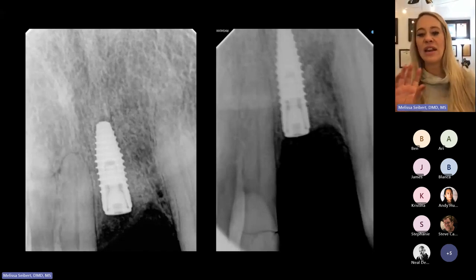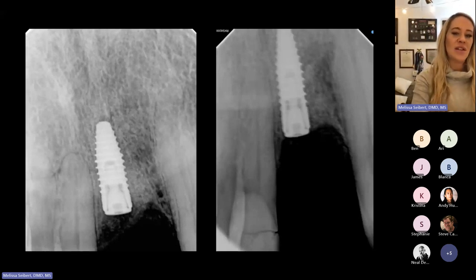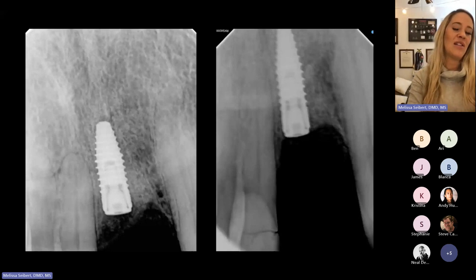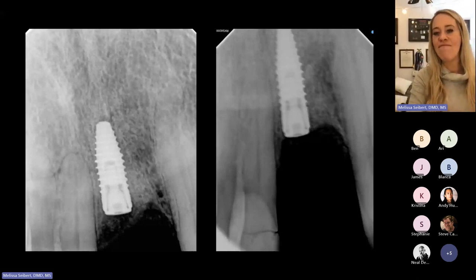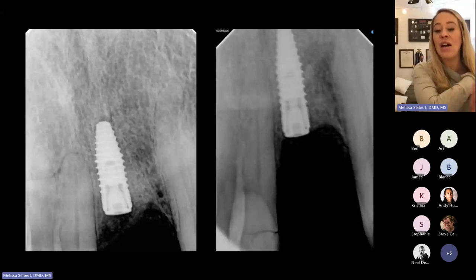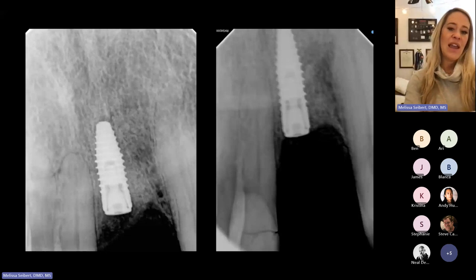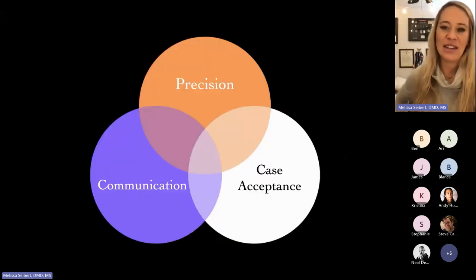Here are different radiographs showing the shaping drills and two-millimeter twist drills and what they look like. There's the final implant placement. This radiograph is distorted — keep in mind you're going to look at it and say the implant looks really far apically, but it is distorted. I generally plan my implants about two to three millimeters from the proposed CEJ. We also crown-lengthened this patient at the time of implant placement, because he had really big teeth where we could afford to do that.